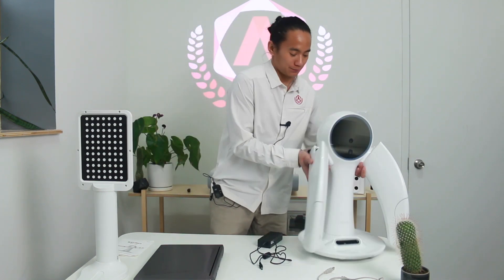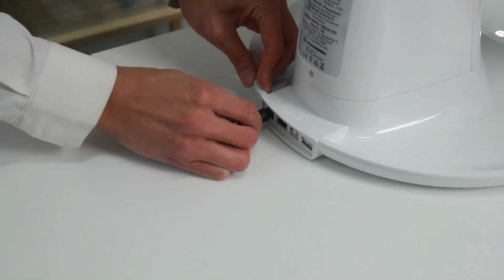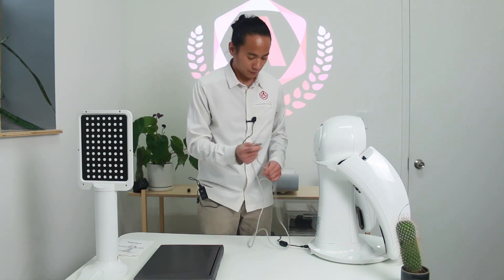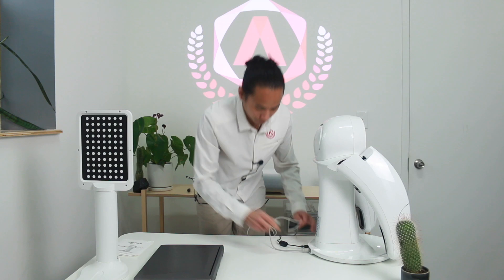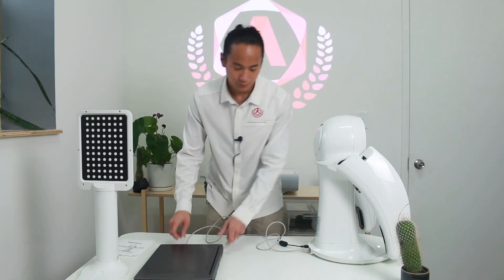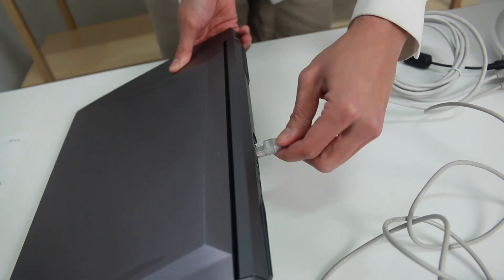After your calibration plate is all set up, the next thing we're going to do is set up the scanner. The scanner comes with three cables. First we're going to plug in the power cable — that's the first notch on the left. From there, plug in the USB cable, making sure you plug it into a USB SuperSpeed port on your computer. Last but not least is the Ethernet cable, and that plugs right in.